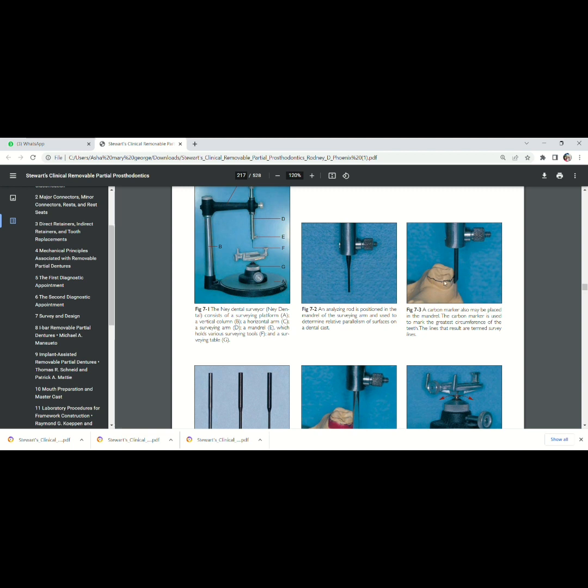This line shows that this is the height of contour. So the area below this line is undercut. The clasp is supposed to engage this area, I mean below the height of contour.